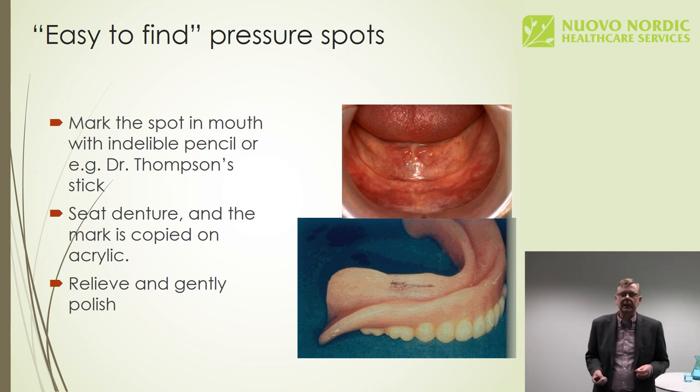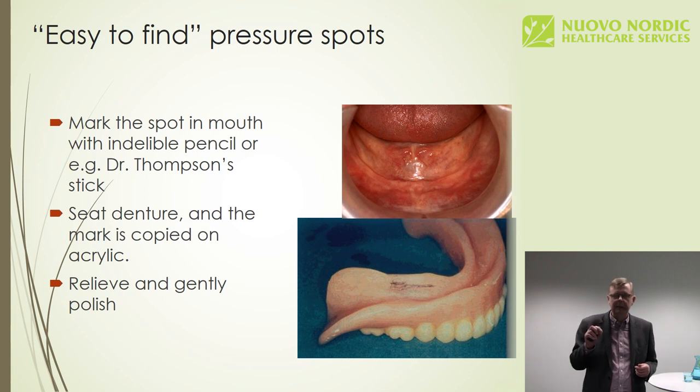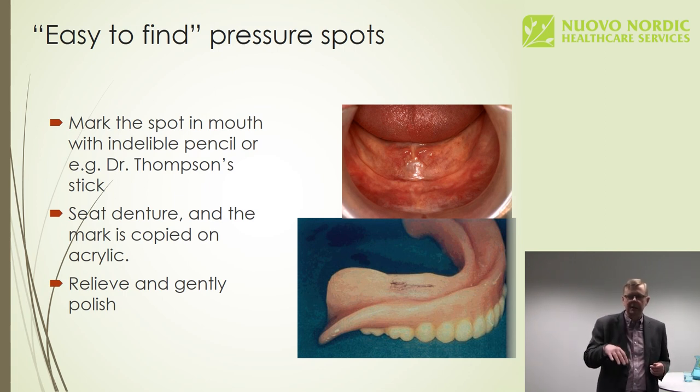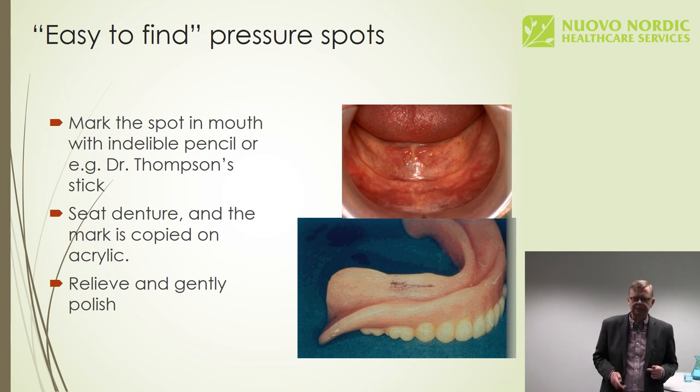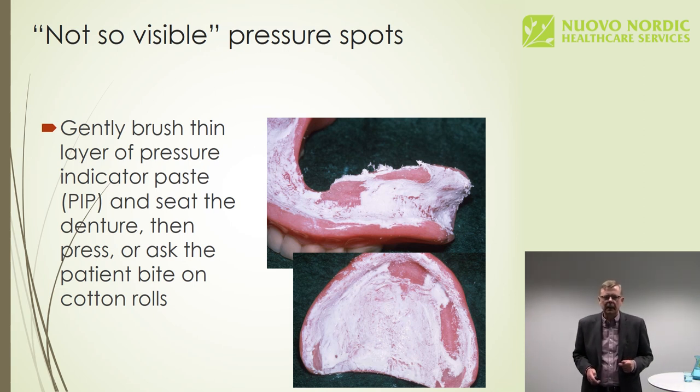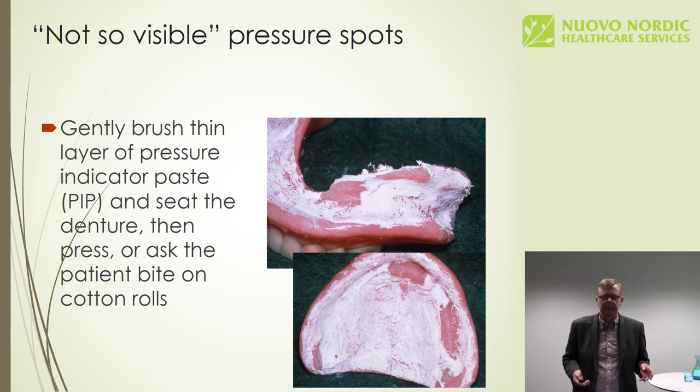Most pressure spots are easy to find because the soft tissues, the ridges, wherever they are, are reddish. They might even be a bit sore. You might simply use an indelible pen by marking the red spot, then seating the denture and hoping the mark will be copied on the denture, or just by eye estimating the spot where you should slightly grind or polish the denture. Of course, you can use pressure indicator paste if it's available. I don't like it personally. I rather use the indelible pen or just my eyes. Anyway, anyone can use the method he likes.